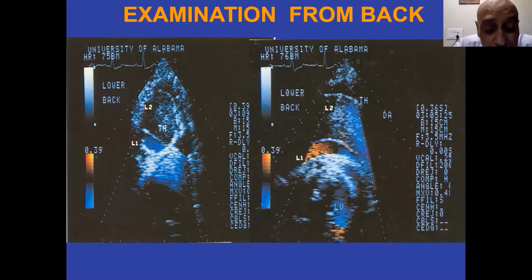But sometimes the off-axis view could be useful to visualize the atrial septum better. As I said, if you get a straight apical four-chamber view, you get an echo dropout in the mid-atrial septum normally. To overcome that, you go into the off-axis position, and then you'll get a well-delineated atrial septum. So what was looking like an atrial septal defect will now appear to be an intact atrial septum once you go to the off-axis position. Is that okay?